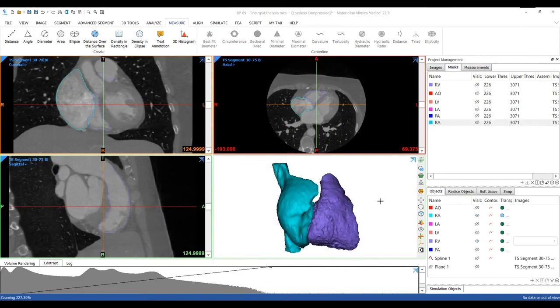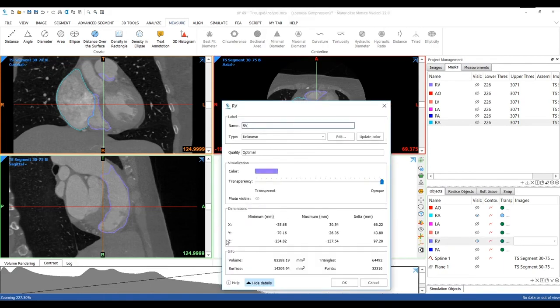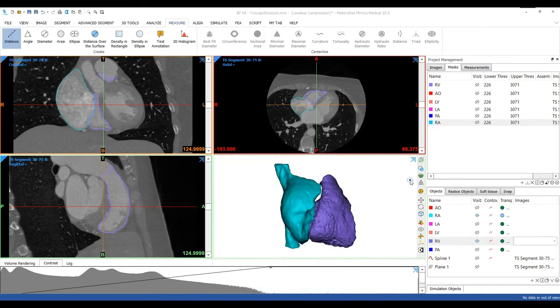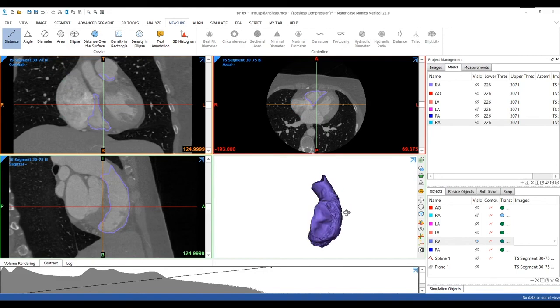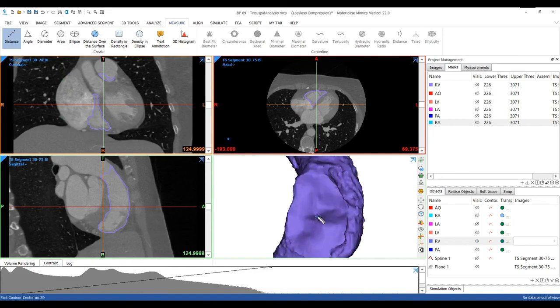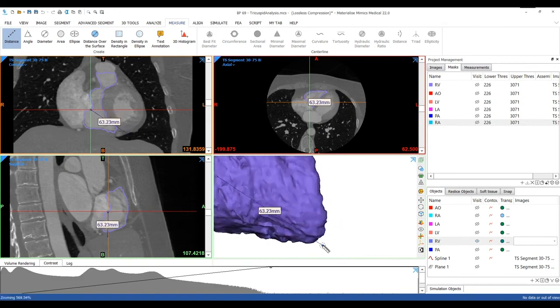For a sound tricuspid replacement and repair device, a quantification of the right ventricle is required. After segmentation, the volumes of the different structures can immediately be obtained from the Properties tab. This could be done in both systole and diastole to get an understanding of the minimum and maximum dimensions. Other measurements such as distances could be performed depending on your needs. Let's for example take a measurement from the tricuspid valve through the apex of the right ventricle.